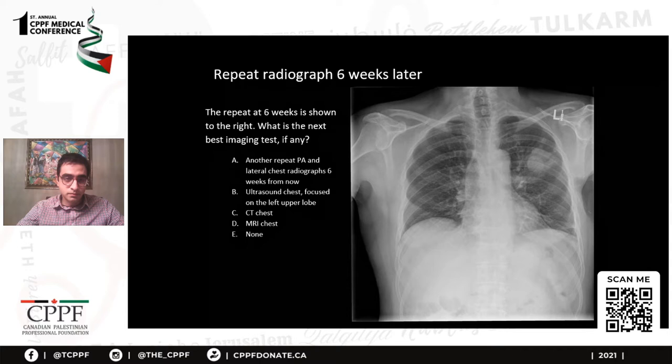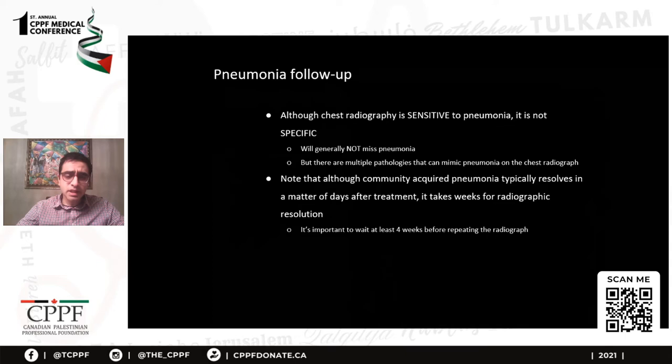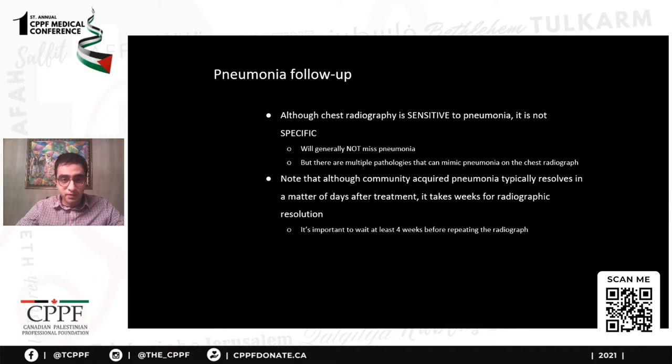Okay, time is up. So the correct answer at this point would be a CT of the chest. And here's why. First off, we have to follow up on pneumonia after treatment. Although a chest X-ray is very, very sensitive to pneumonia, it is not specific. So what that means is it will not miss pneumonia, but there are multiple pathologies that will look the same on the X-ray. So an X-ray that looks like pneumonia might be pneumonia or might be something else.